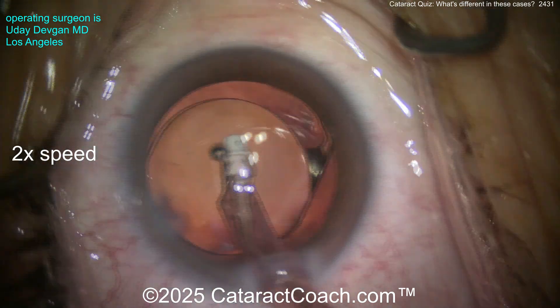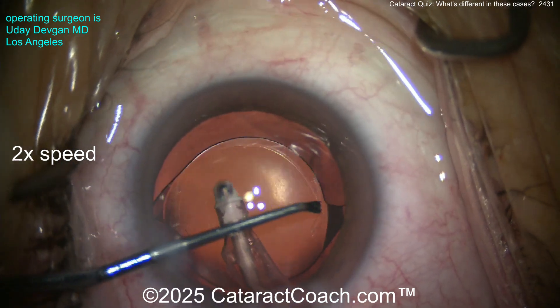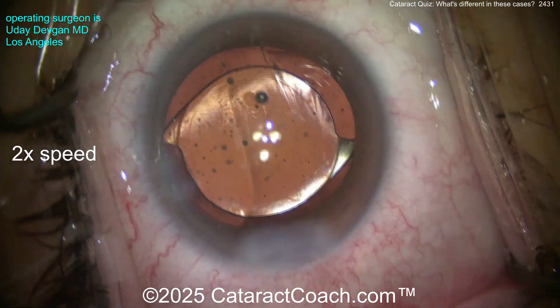Is there a little bit of cortex remaining? There you go — there's a little bit left. This is a nice outcome for the patient, of no consequence. The haptic there is providing some bolstering or support. At the end here you can put some triamcinolone if you want.